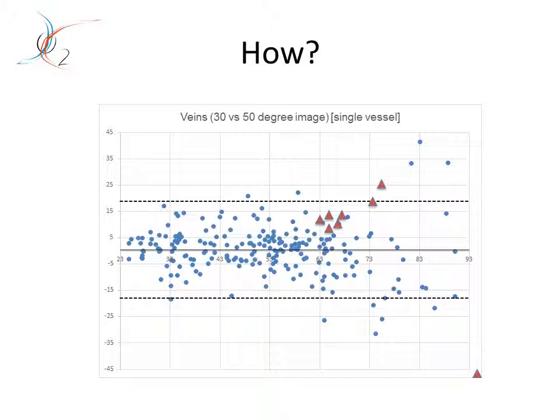I think if you had a very large normative database, for example, and you've observed patients over a longer time, you have the information about age and how things progress through age, but also through pathology. You could then utilize that collective knowledge of such a large group, and if you have your patient, as represented here by the red triangles, you could plot them from visit to visit.